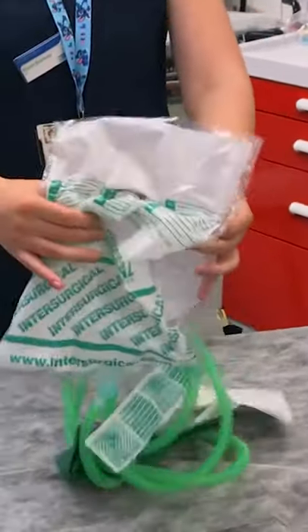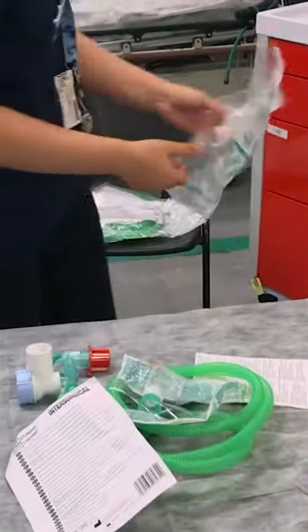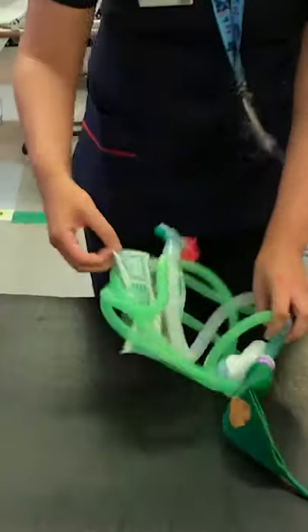Open the C-circuit bag — it's easiest if you open it onto a hard surface, otherwise the stuff just goes everywhere. Don't lose that little bag inside though; this contains a white rubber attachment that allows the C-circuit to be attached to the wall oxygen.